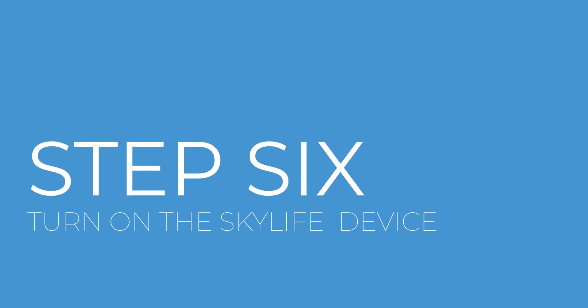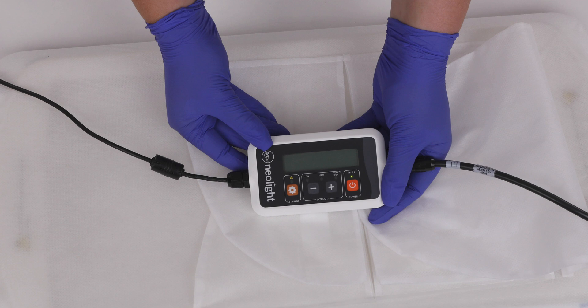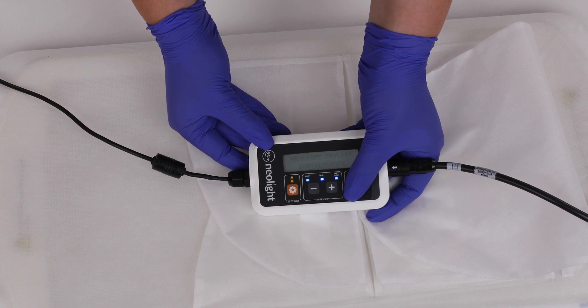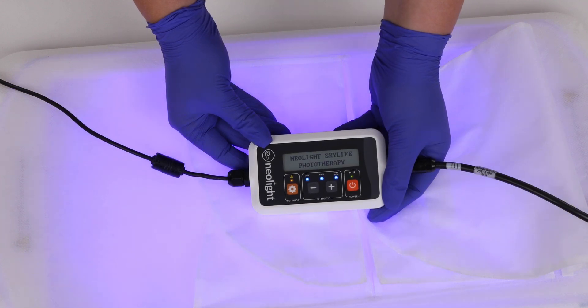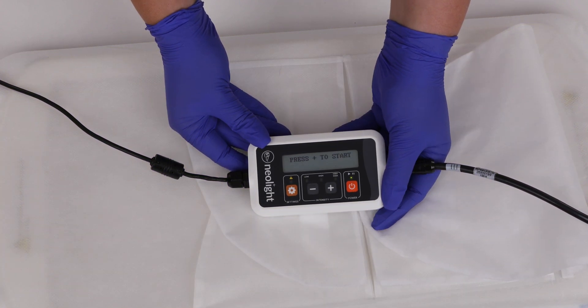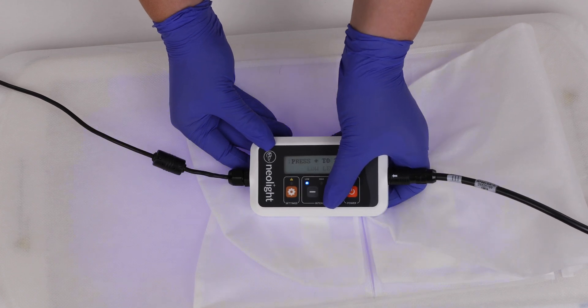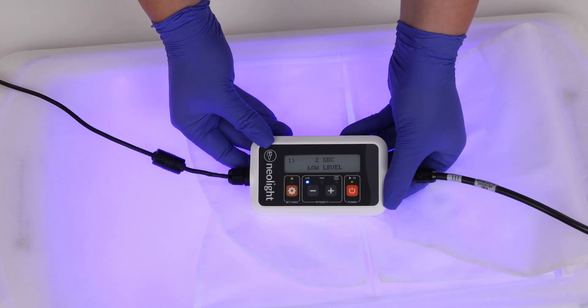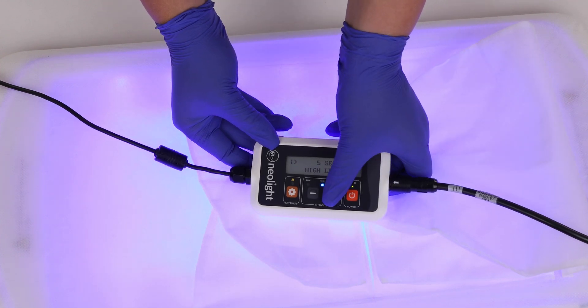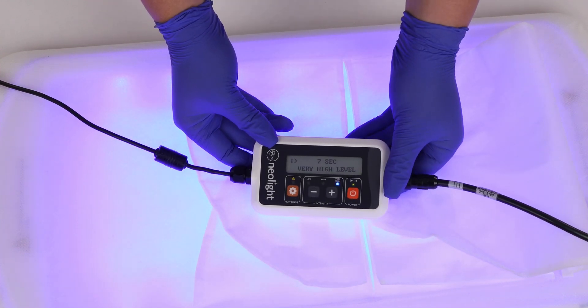Step 6: You are now ready to begin treatment by turning on the Skylife device. To power on the device, press and hold the power button on the controller until you hear a beep and the lights come on. After the Skylife controller has powered on, you may press the plus button to begin treatment. The plus and minus buttons allow you to set the light intensity to the level prescribed by your physician.